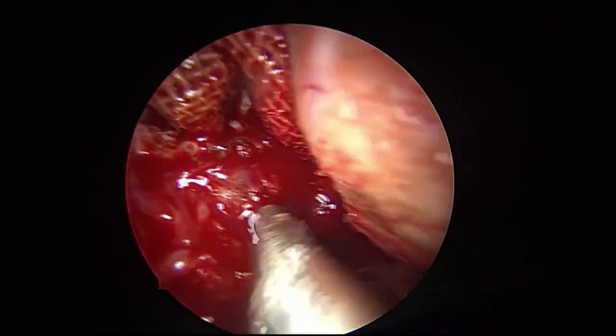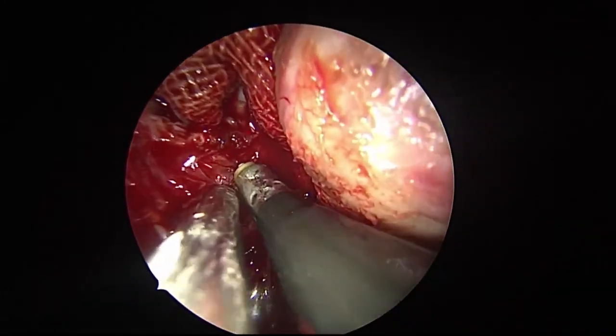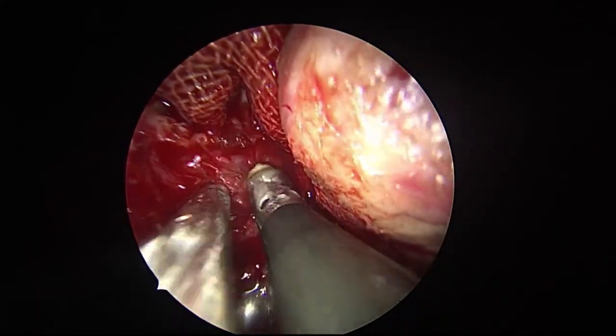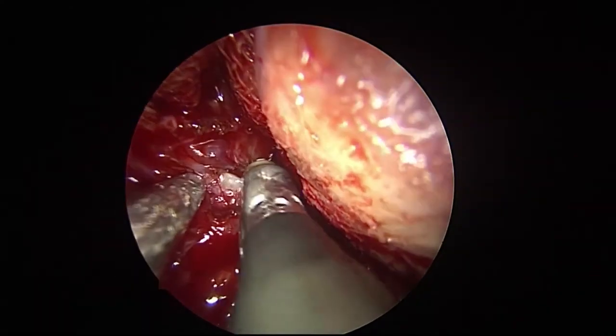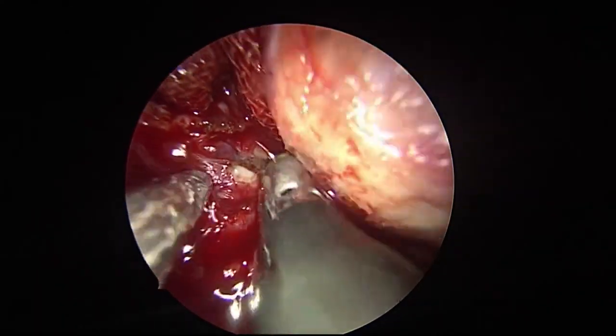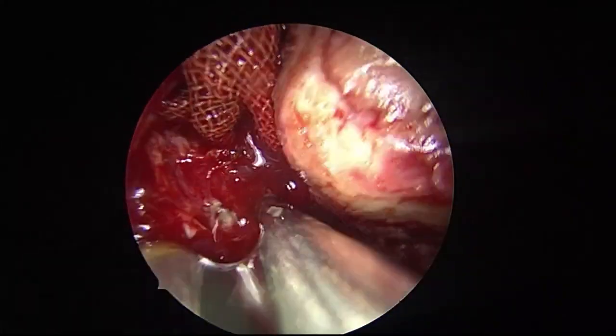Coblator. See the vessel? Yes, sir. So you'll be using clips after delineating. 100%. Clip is the safest way.